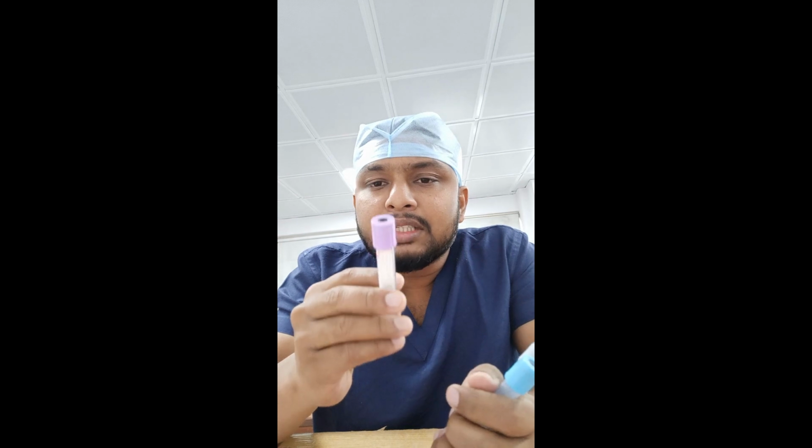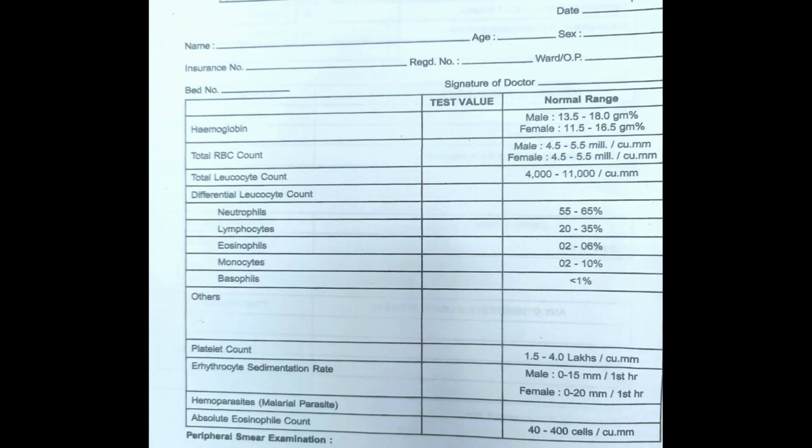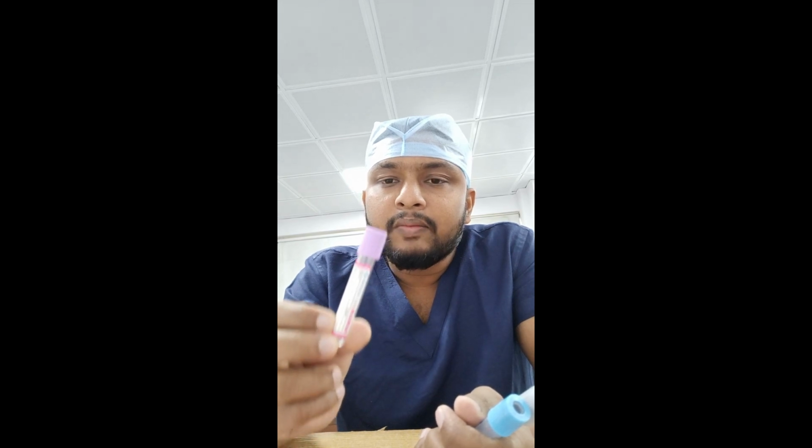This container mainly goes to pathology, for CBP, complete blood picture, HB, WBC, RBCs, platelets, MCV, PCV. All these are tested in this container. Some special tests like HbA1c are also taken in this container and sent to biochemistry.